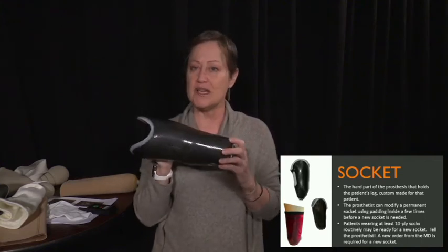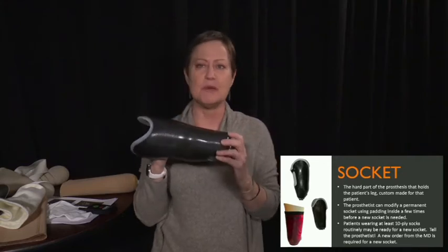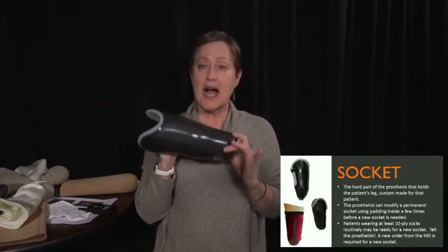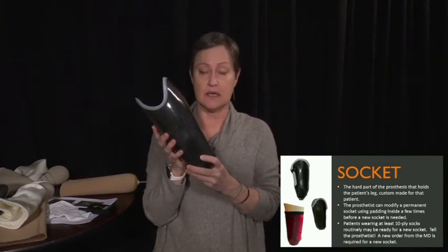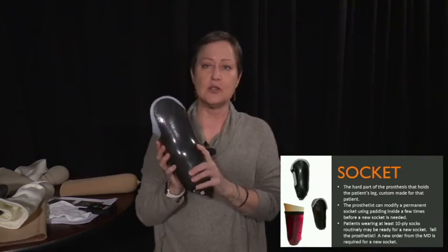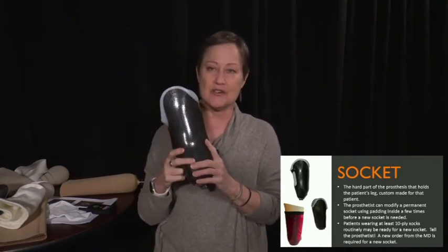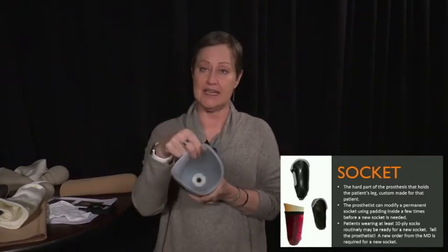This is another great reason to have a conversation with the prosthetist who made the leg. Hey, the socket doesn't seem to be fitting well. Could you take a look at it when the patient comes in to see you for a follow-up? Prosthetists can modify sockets. I mentioned that this is custom, and with this particular final laminated version of a socket, you can't really do a lot of heat molding like you can on some of the earlier versions of a socket. But what they can do is add padding inside the socket.